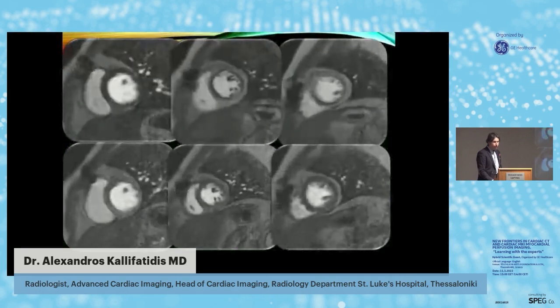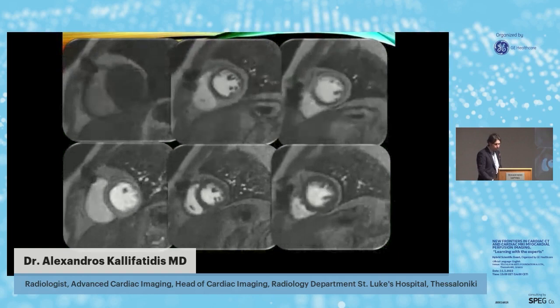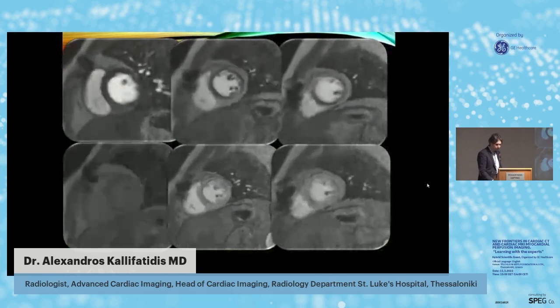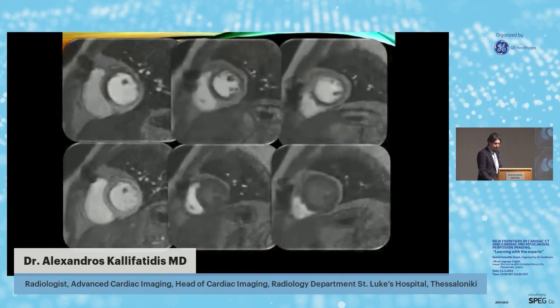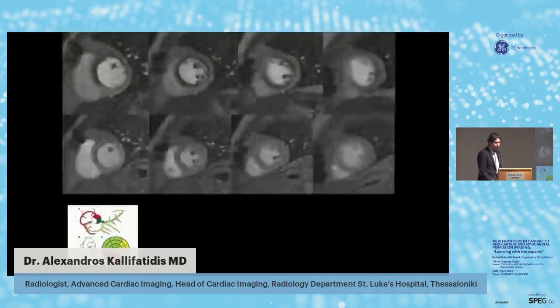Afterwards, I will show you the stress perfusion images in the upper row, and in the lower row the rest perfusion. Please check carefully if you see any perfusion defect. I will show you the static images in the upper row during the stress, and here during the rest.